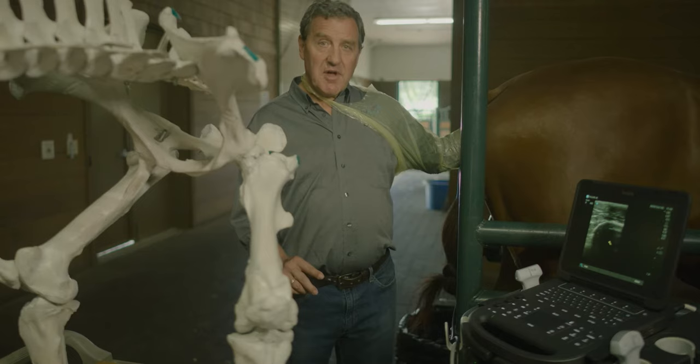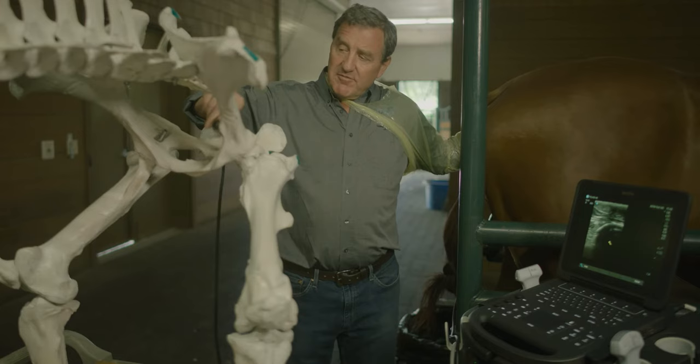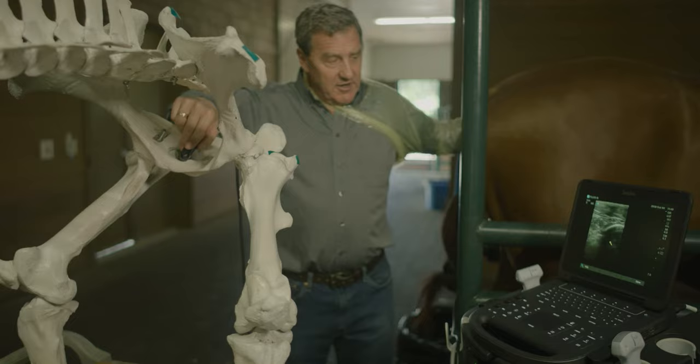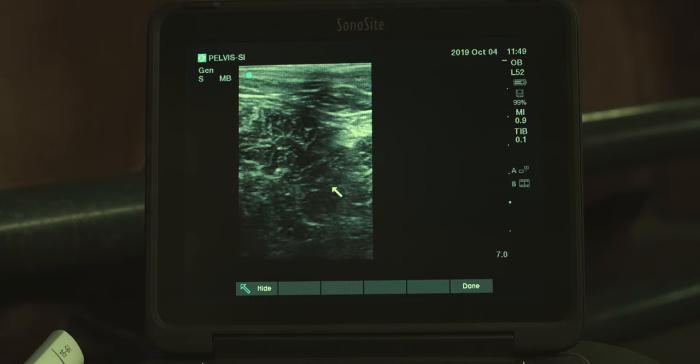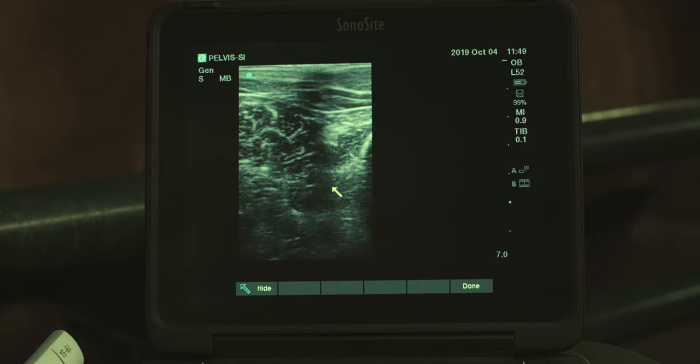Moving on to the transrectal portion of the pelvic survey, we're going to start with the pelvic floor. We're going to start there by looking at the obturator foramen. If you look at the pelvic specimen, I have my probe positioned over the obturator foramen, and on the screen that's the appearance of looking through the obturator foramen.